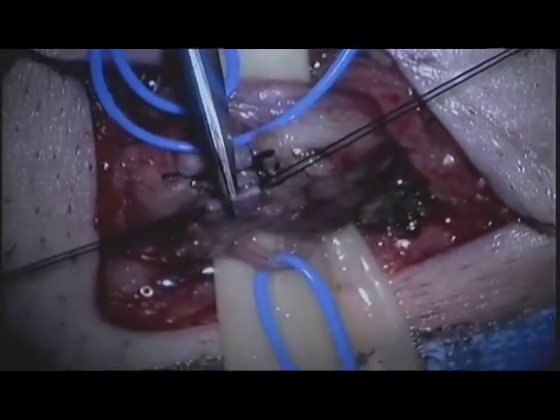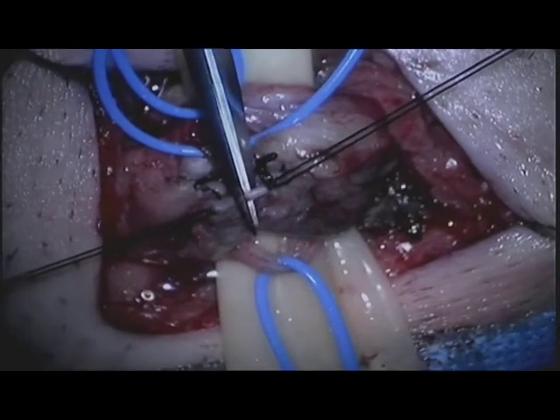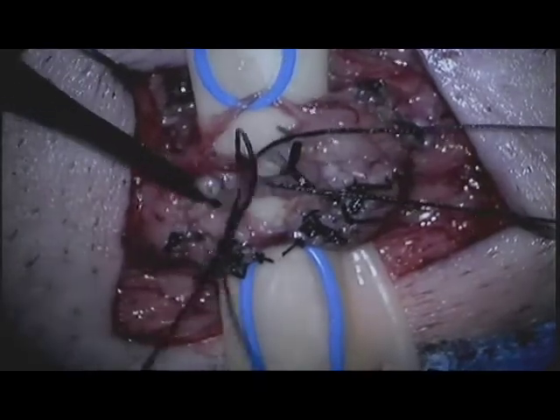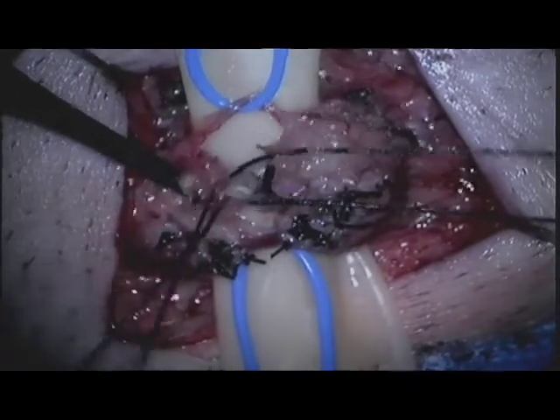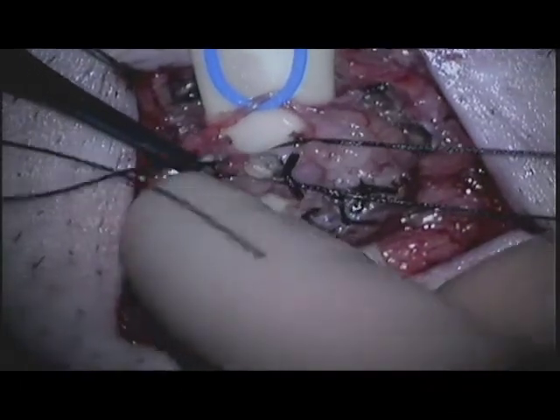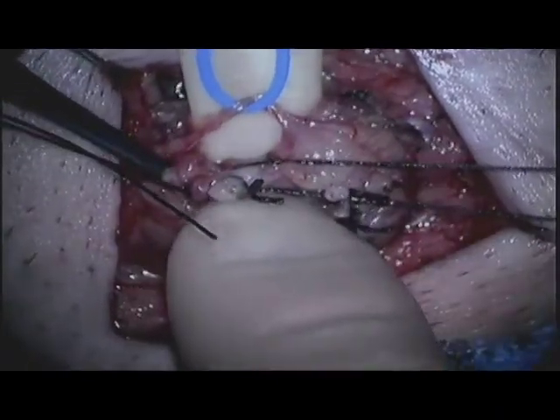With the venous structures transected, the main testicular artery becomes apparent and can be seen at the bottom of the screen. Since the testicular artery has been confirmed to be patent, the vasal packet is now transected.